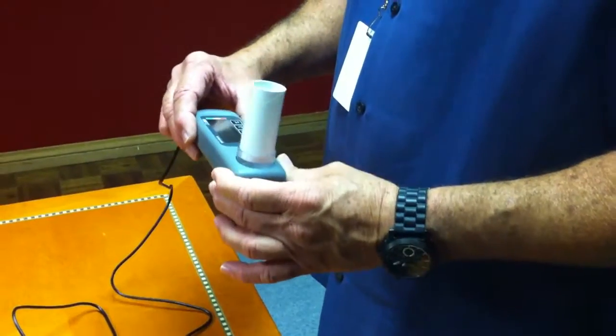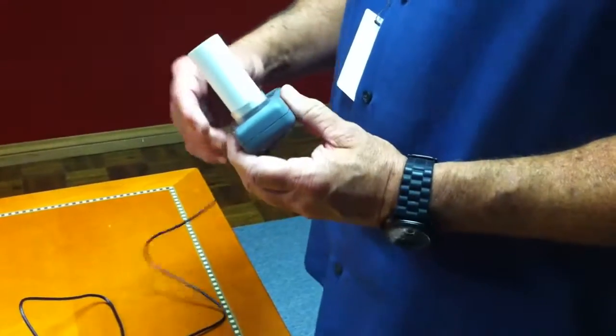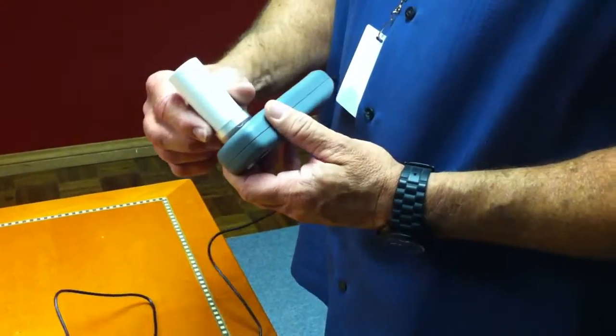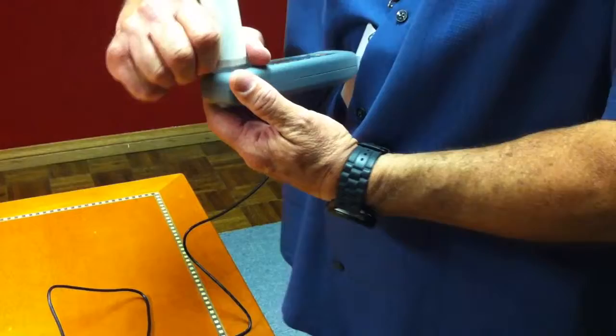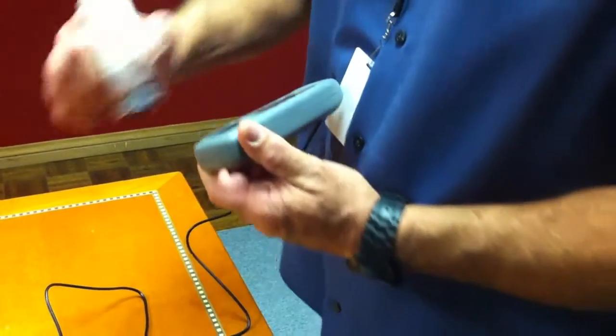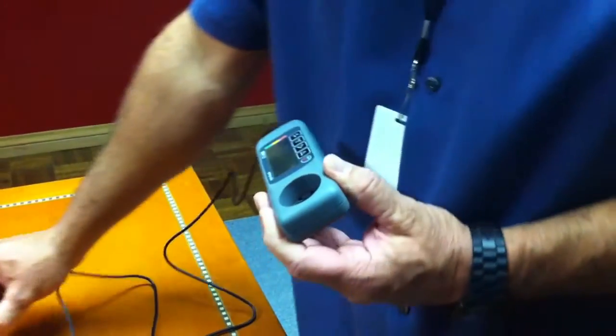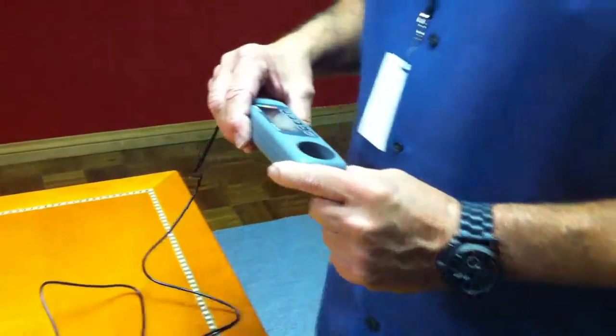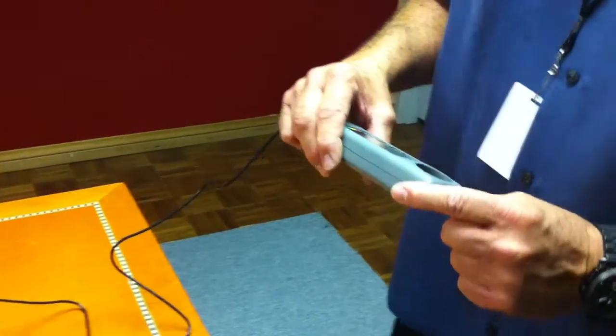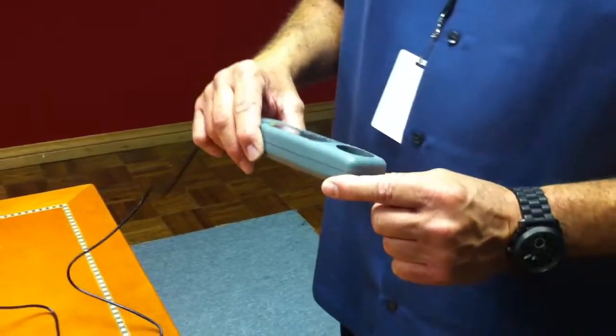After the test is completed, disconnect the disposable turbine and dispose of it in the trash because you want one patient use per turbine.